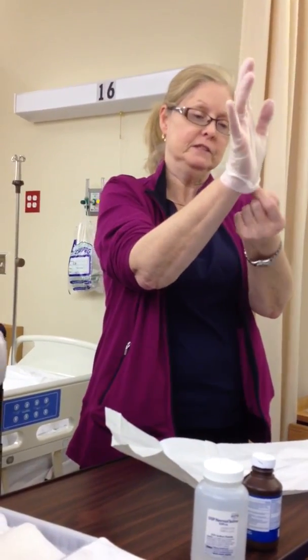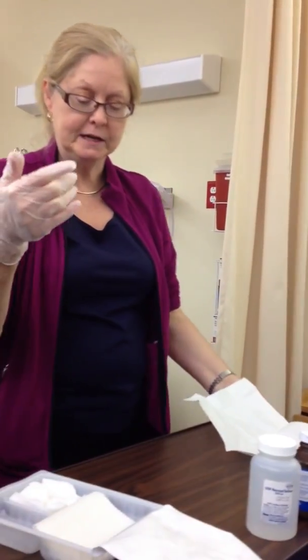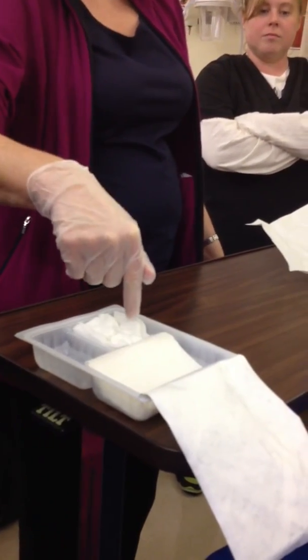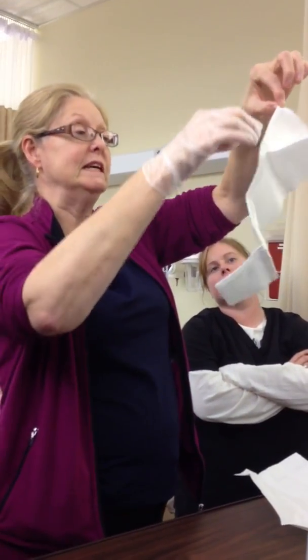Okay, so there, glove is on. Just be careful with it. And this is still sterile, and I'm not ready to pick that up yet. So what I need to do now, though, is come over here, and I can adjust my tray again because I am sterile to sterile, right? Sterile glove to here. So what I need to do now is get everything out of here and onto the table. So here's my drape, and remember the shiny side goes down.